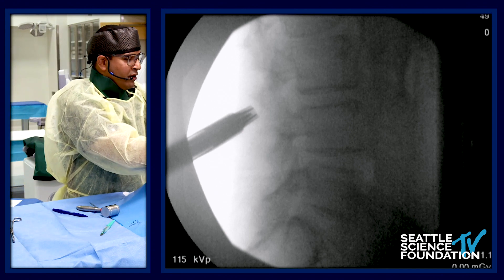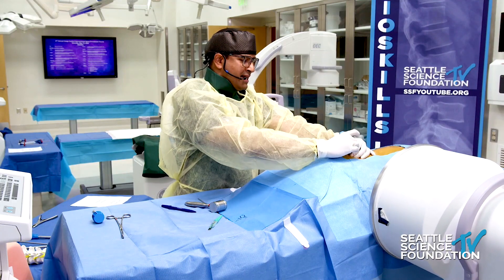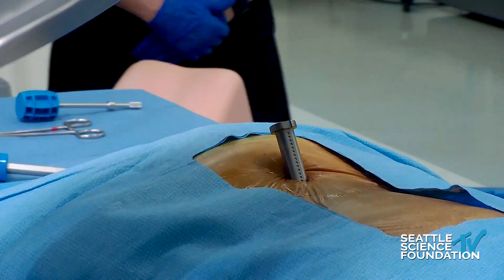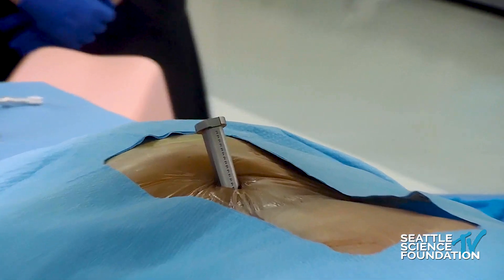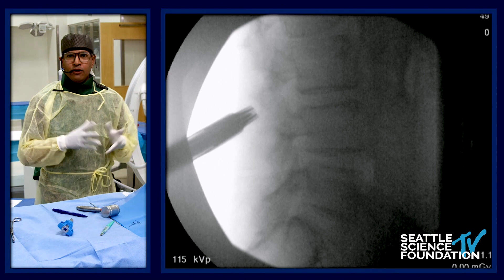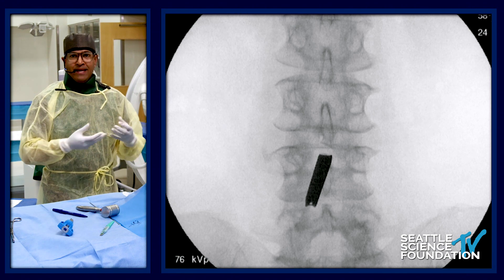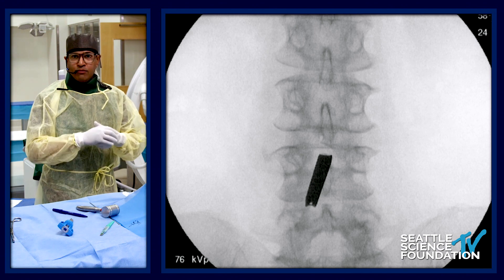I didn't do a lot of fluoroscopy checks in between. As you're starting out, it's really important to go back and forth between AP and lateral, but I've done a few of these and have feel for it. My cannula might be a little bit off, but I feel like I'm in the right groove. Use all the senses with this therapy — when you know you're in the interspinous space, there's nice purchase and everything follows because of the instrument design.